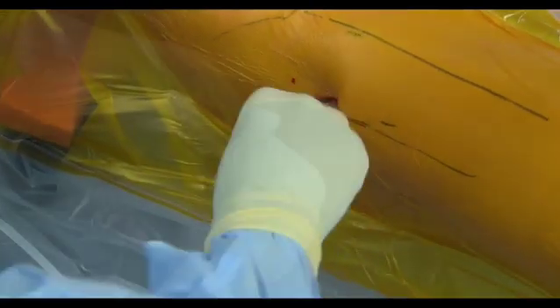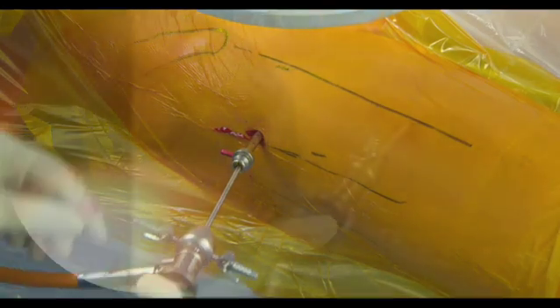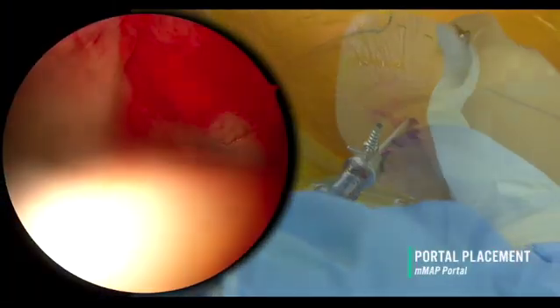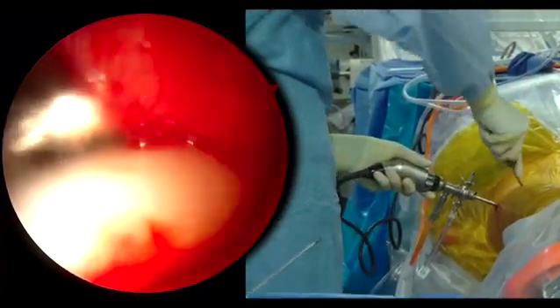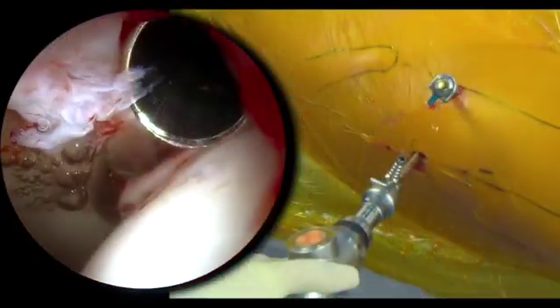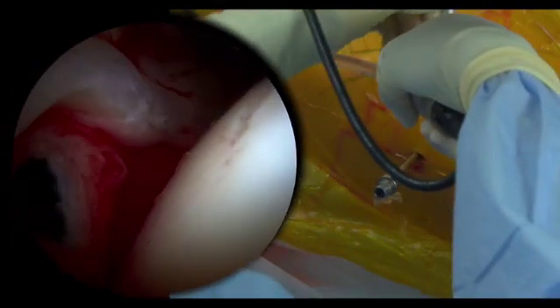Next, a 5.5 mm cannula is inserted to gain access to the joint. The modified mid-anterior portal is then crafted in an outside-in fashion. It lies three finger widths medial to the anterolateral portal and within the safe confines of the arthroscopic triangle between the labrum, the femoral head, and the hip's capsule. Another 5.5 mm cannula is inserted at this point and the anterolateral portal checked for accuracy.